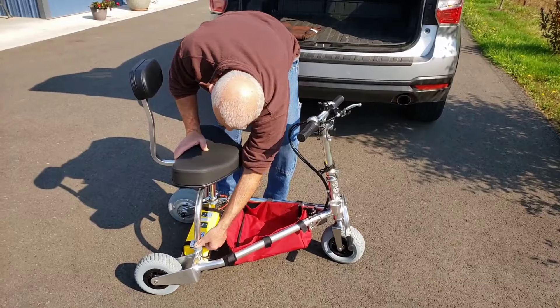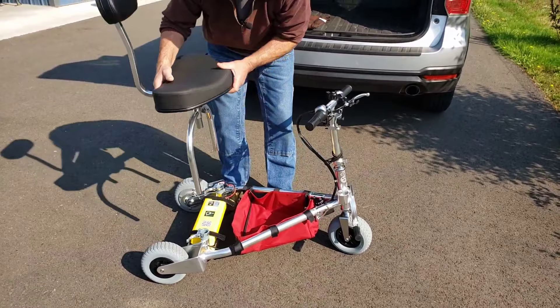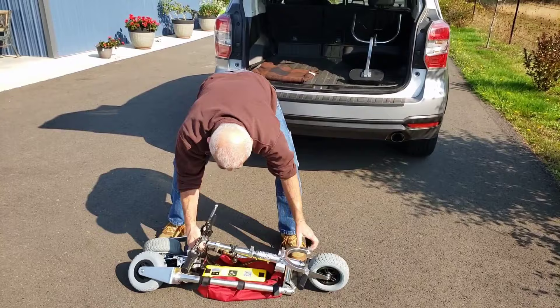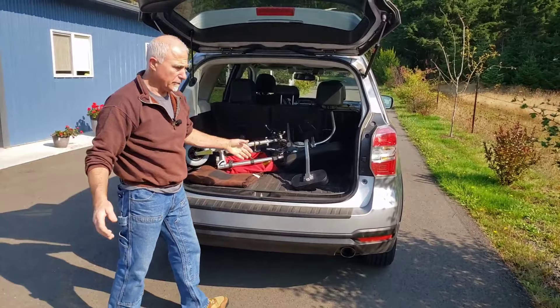This is how quickly you can load up. Remove the seat assembly — 6 pounds — place it in there, place the battery in the caddy, snap, snap, and you're done. Quick and dirty.